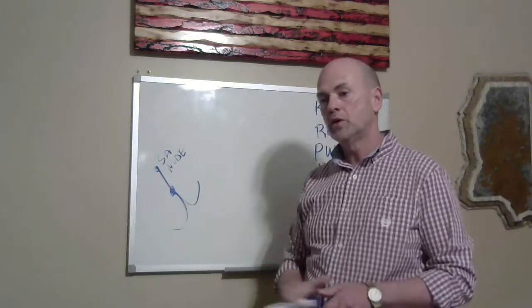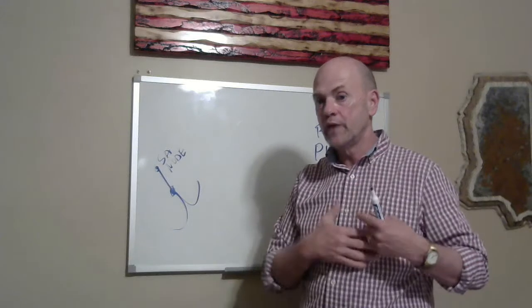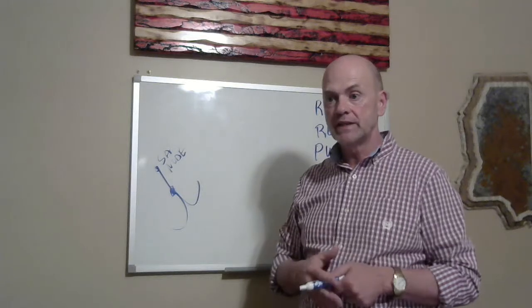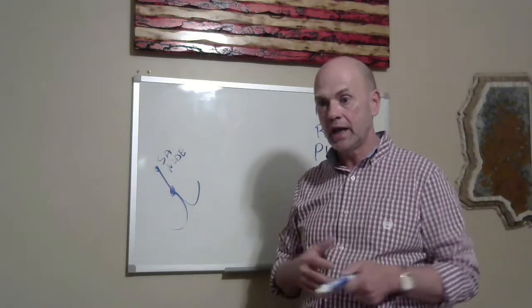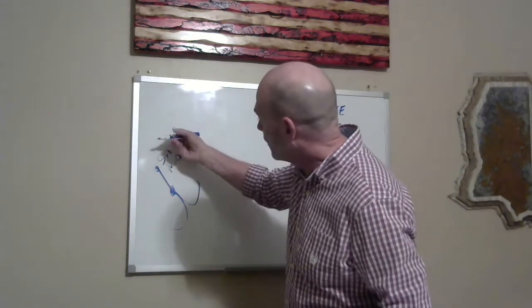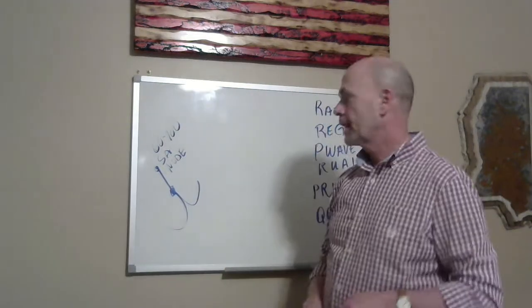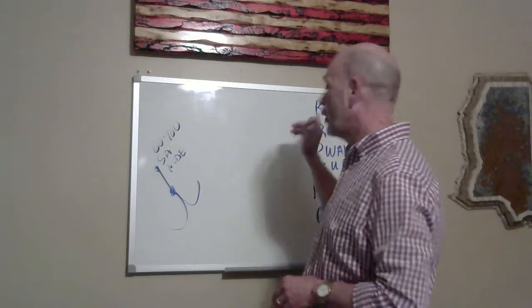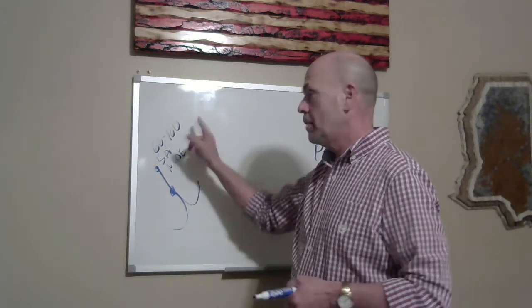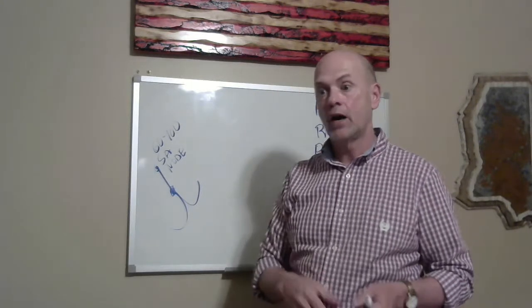This is the electrical impulse that begins the cascade of electrical stimuli through the interatrial pathways that cause the depolarization of all the atrial cells simultaneously to generate that atrial kick. The SA node has an intrinsic firing rate of 60 to 100. When we look at rate and we're determining the rhythm, we'll keep in mind that if it's outside of 60 to 100, it is an arrhythmia.